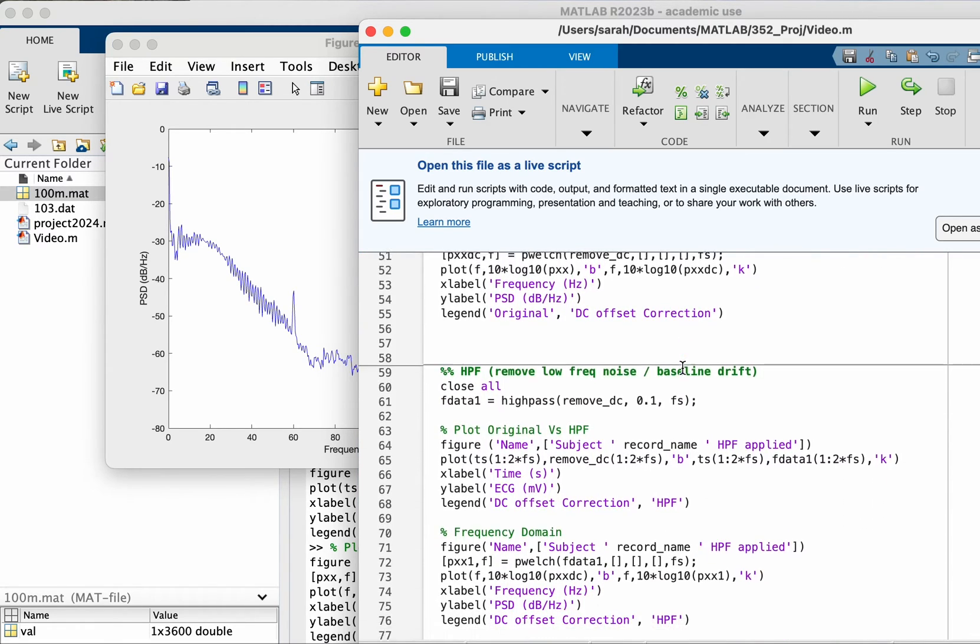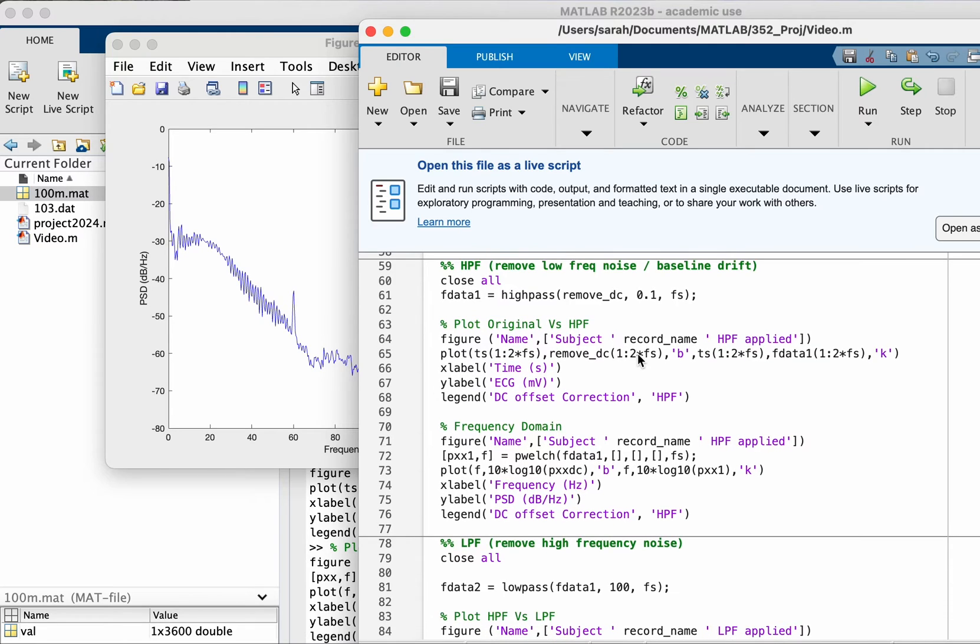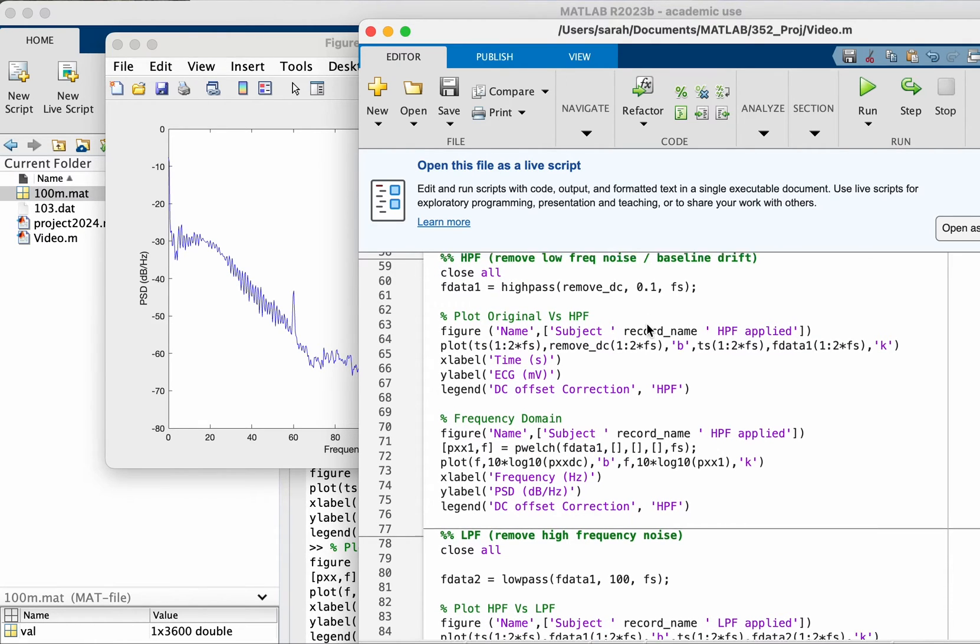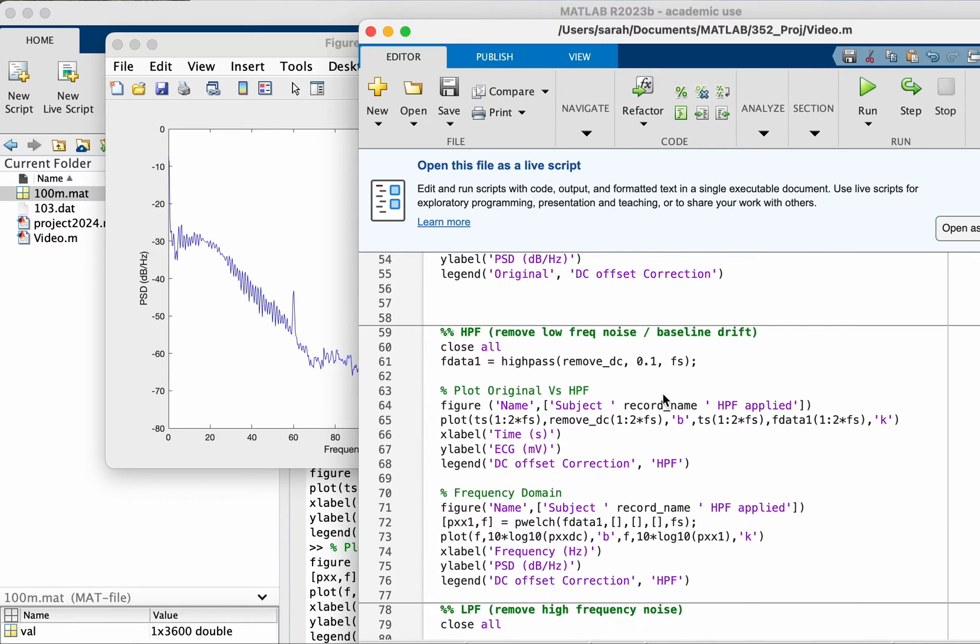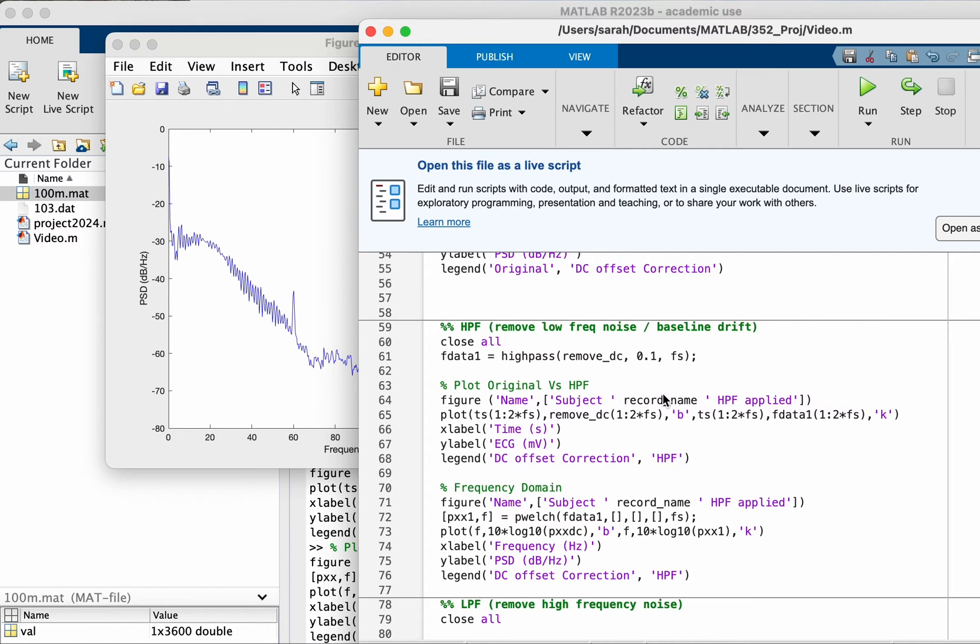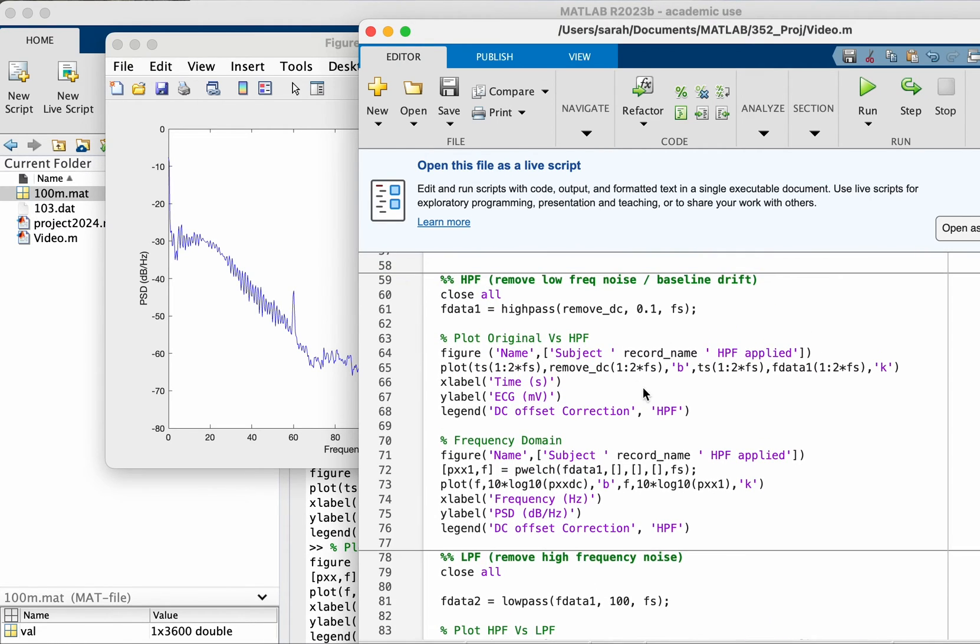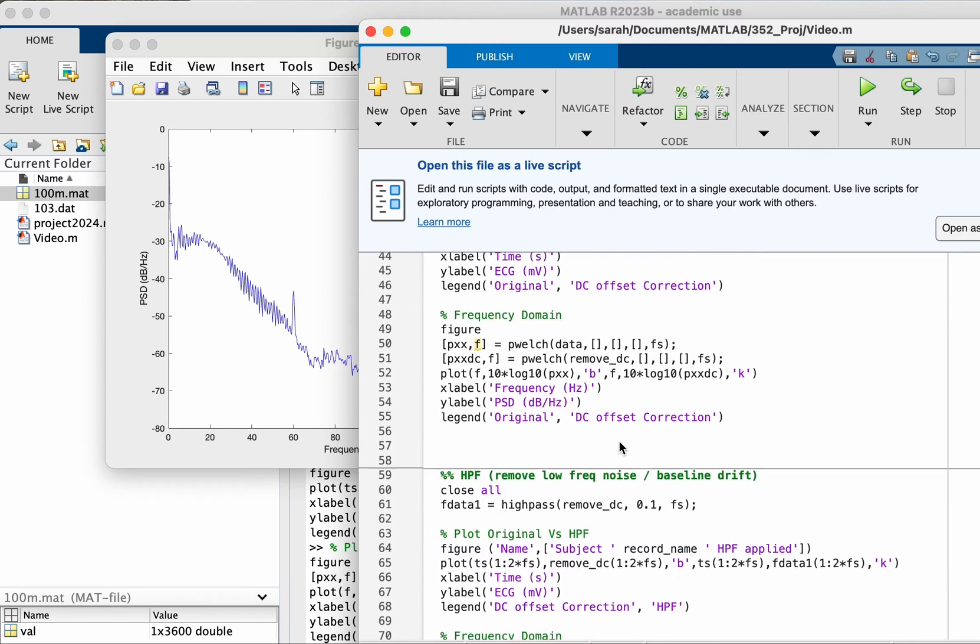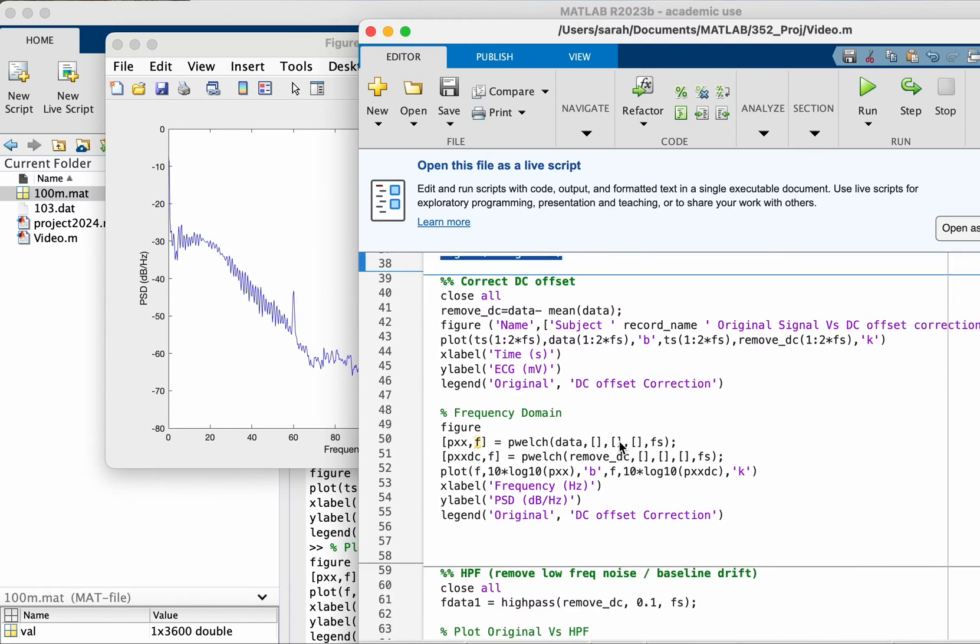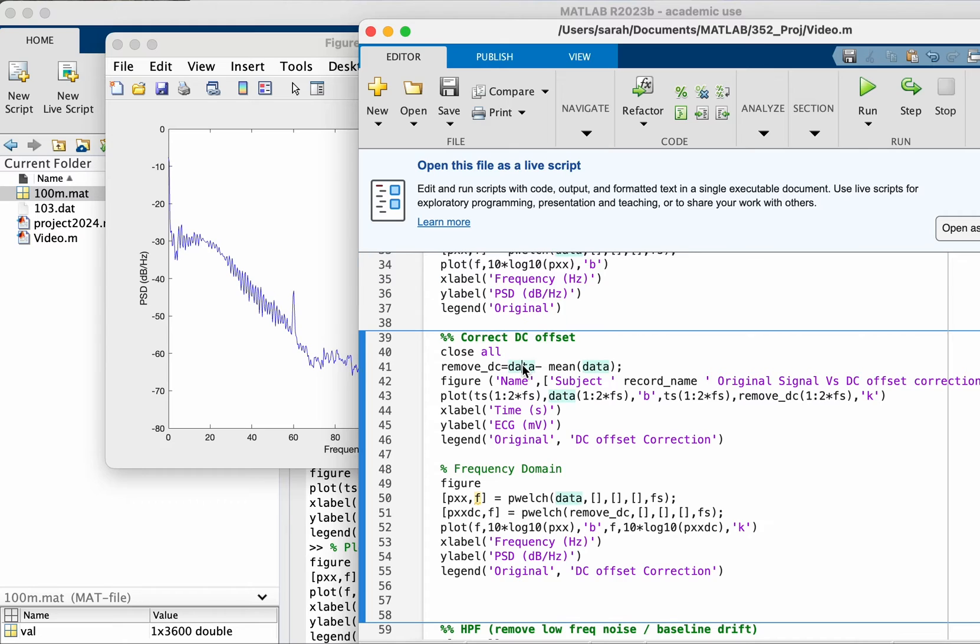I found a source that says you can filter from 0.1 until 100. Some people actually use from 0.5 to 40. It depends on what you want to look at. I'm going to take a larger range, from 0.1 to 100.